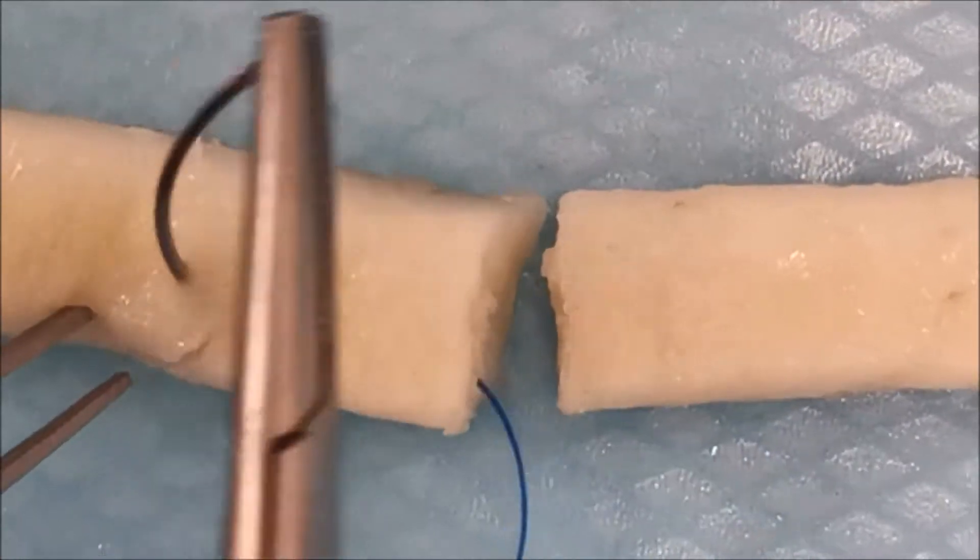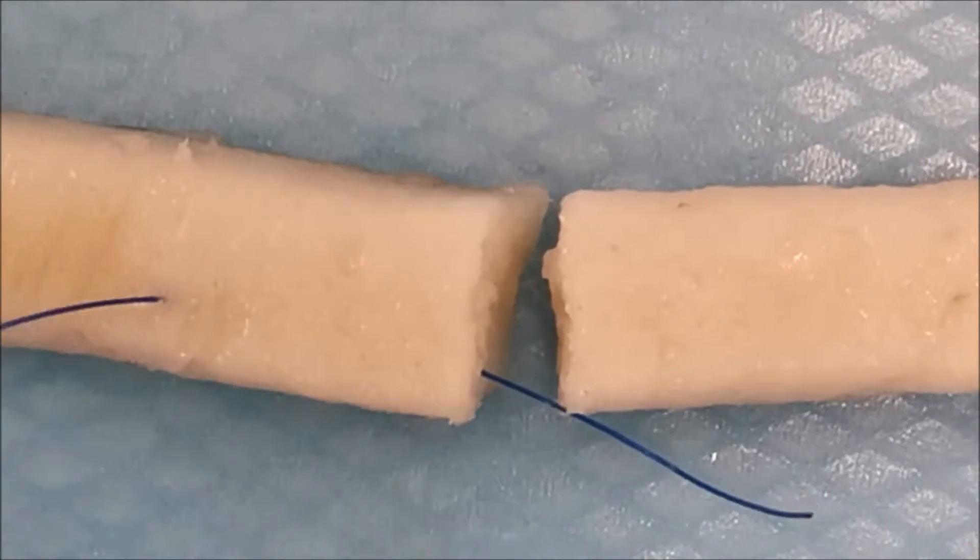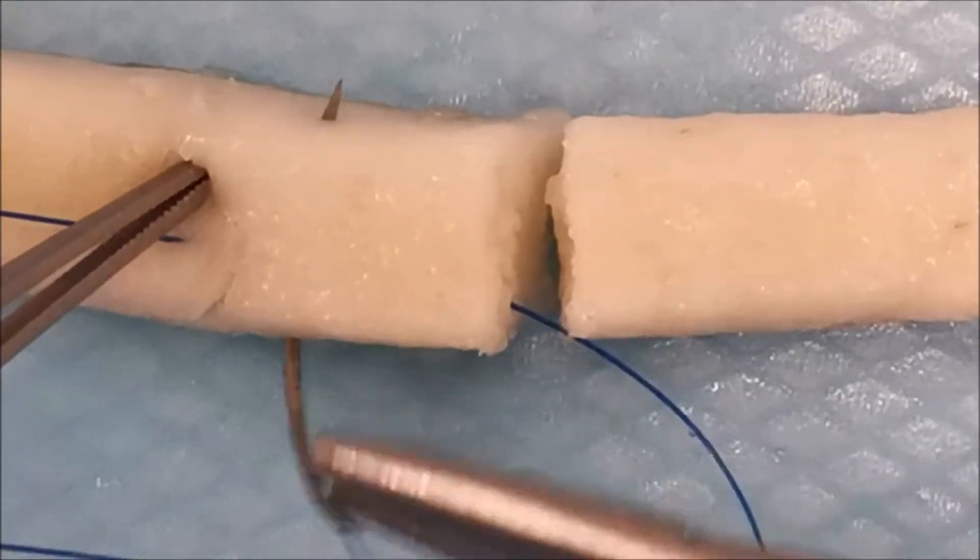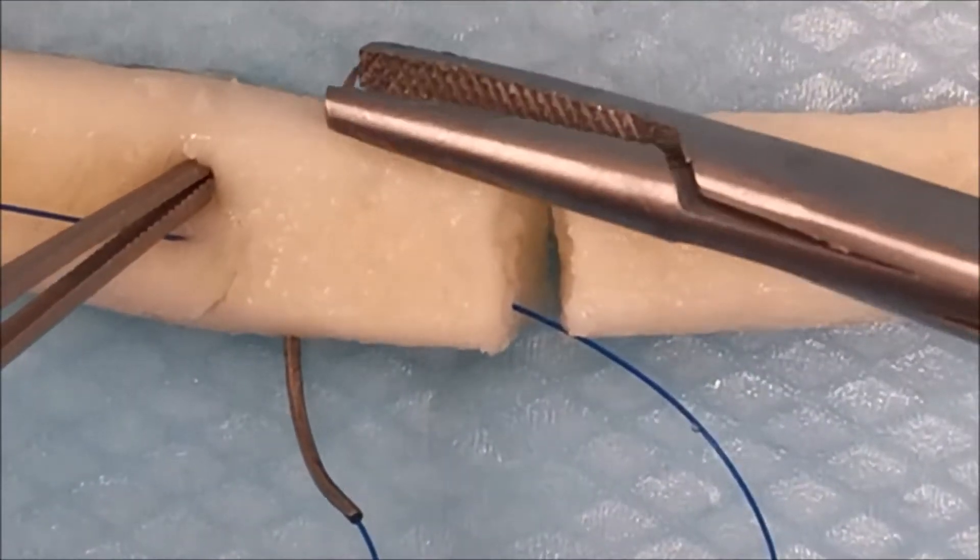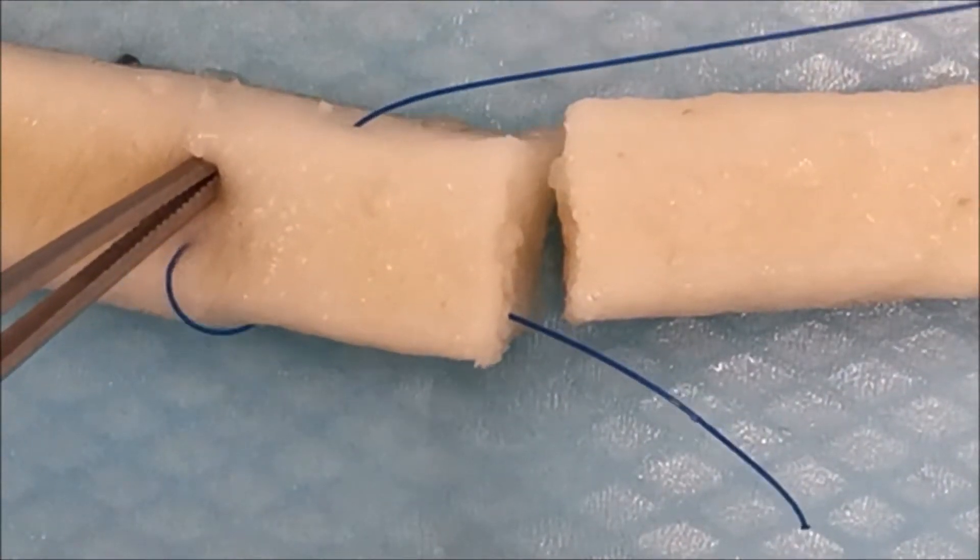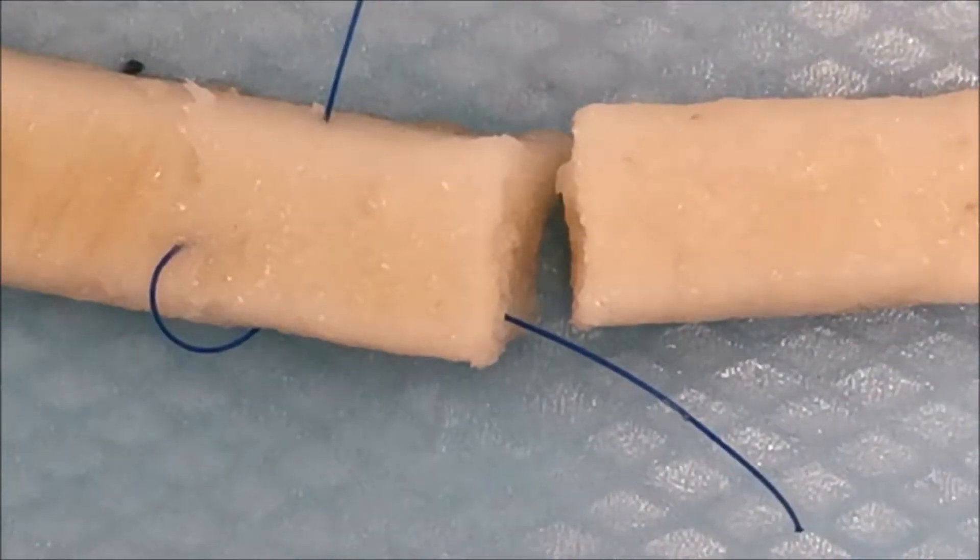Your first suture on your side is a straight longitudinal bite taking at least a centimeter if you can, followed by a transverse bite creating the first grasping loop.